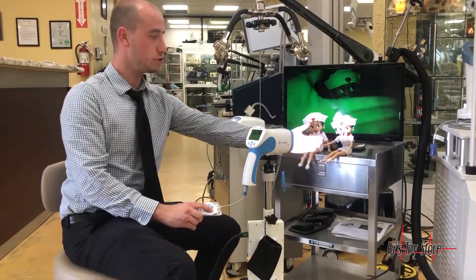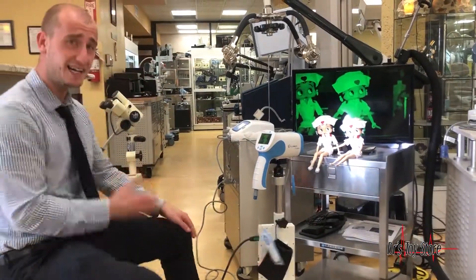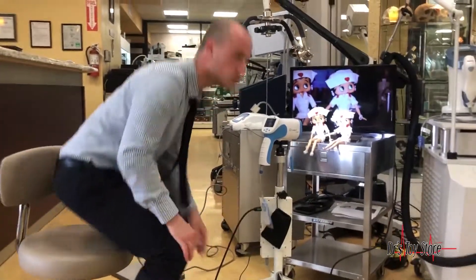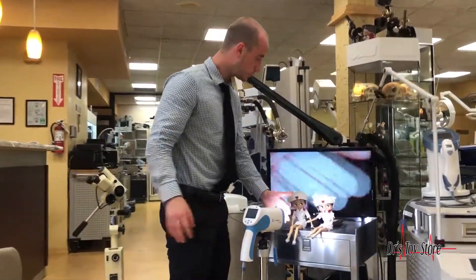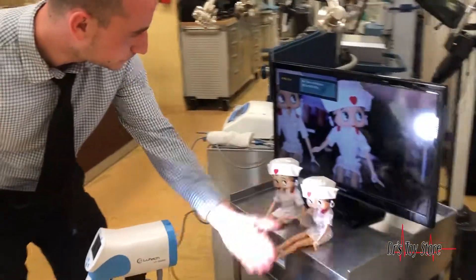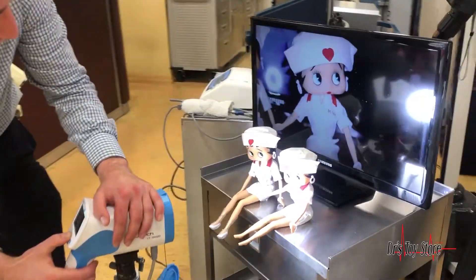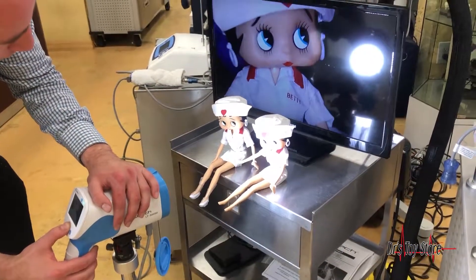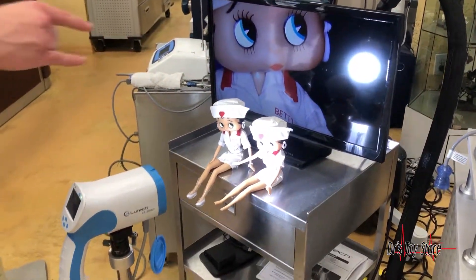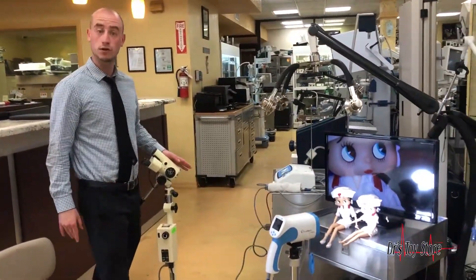Your light you can change, as you can see here. And this is high definition — you can see everything, you really get a very good look. So let me show you how good this colposcope can be. Let it autofocus for you, and then you can go really close. Look at that — that is an image. And to focus something like that with a manual colposcope takes forever; it really does take a long time.